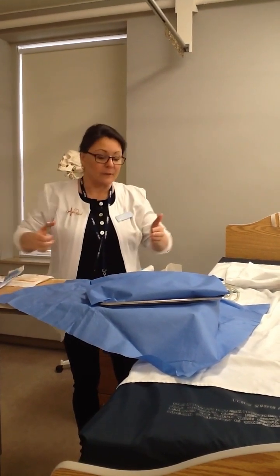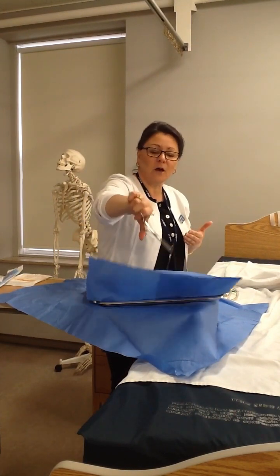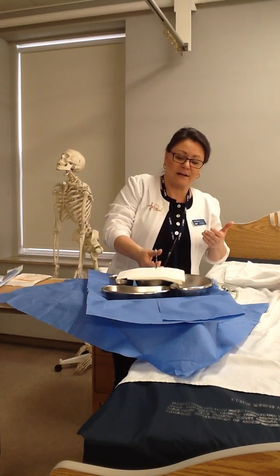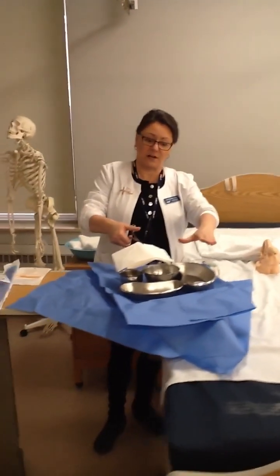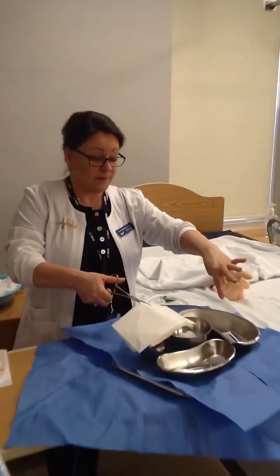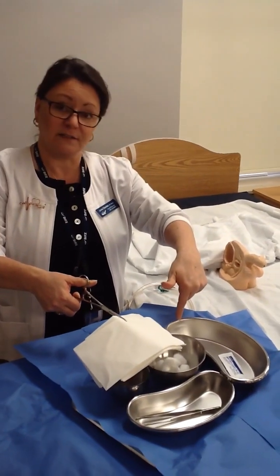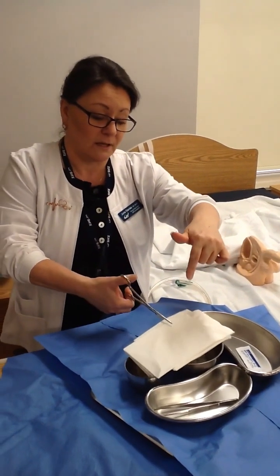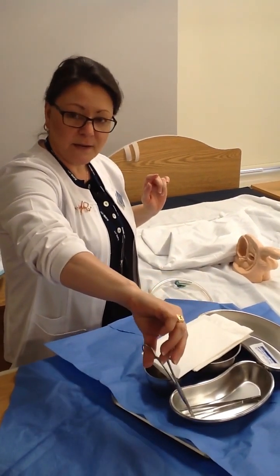So when I pick this back up, I'm going to open up this second set of drapes now. And the first drape again is always away. Okay? Next drape is towards me. If we look inside quickly, we can see what we have there. I have a large emesis basin to the left. This is the one we're going to use to insert our catheter. I have sterile lubricant in there that I'm going to open up after I have my sterile gloves on, and I'm going to dollop right here in the corner. I have a smaller emesis basin right here. If the physician ordered a sterile specimen to be taken, that would be the basin that I would use.